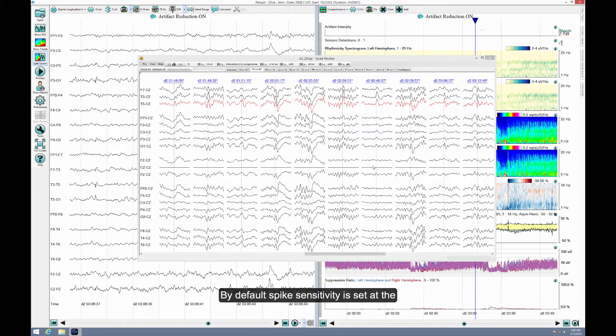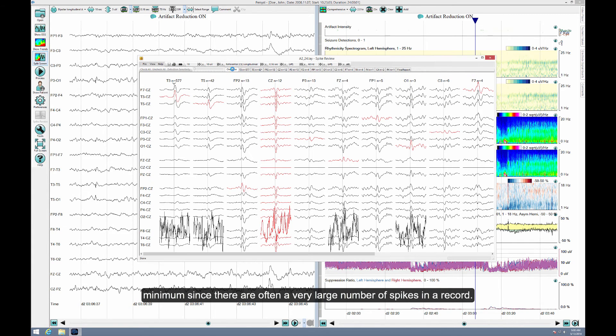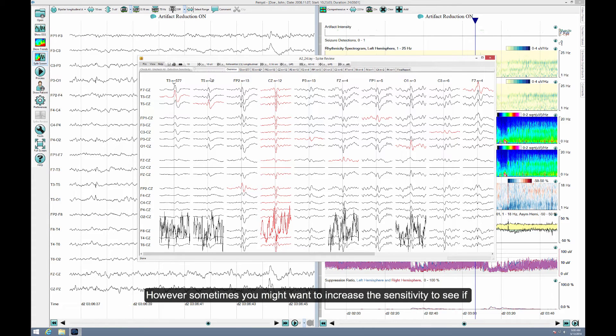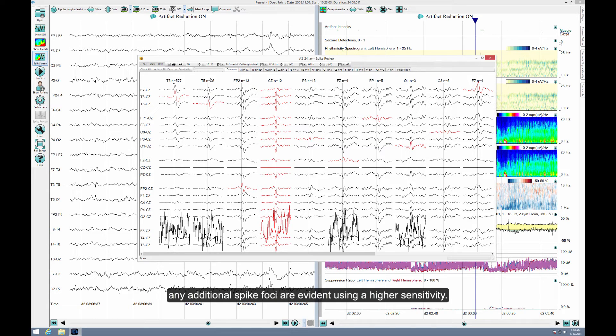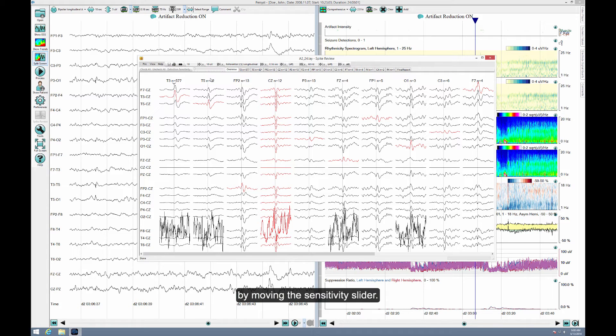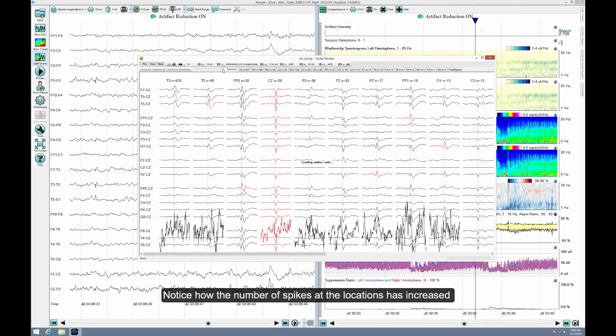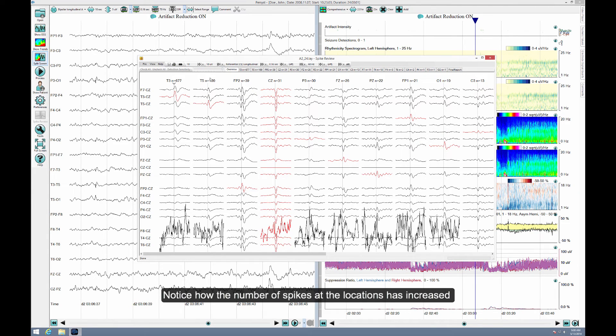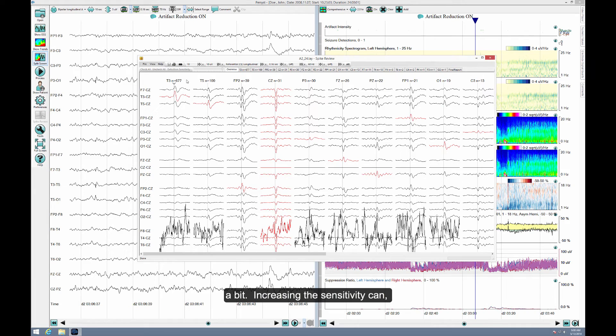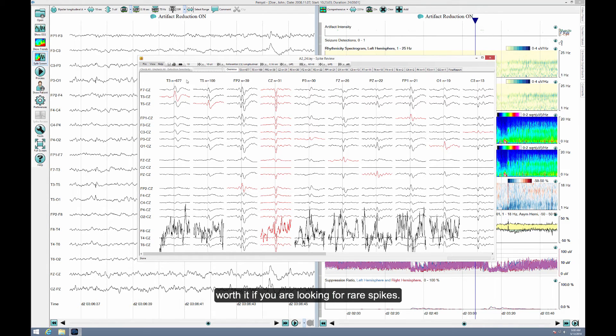By default, spike sensitivity is set at the minimum since there are often a very large number of spikes in the record. However, sometimes you might want to increase the sensitivity to see if any additional spike foci are evident using a higher sensitivity. You can do this dynamically without reprocessing the record by moving the sensitivity slider. Notice how the number of spikes at the locations has increased a bit. Increasing the sensitivity can, of course, also introduce more false positives, but this may be worth it if you are looking for rare spikes.